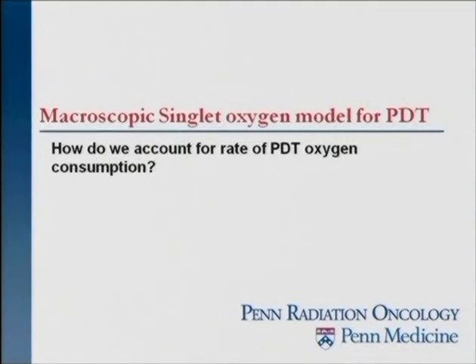So we talk about light, and we currently lack a good way of determining the sensitizer distribution. We can only know the sensitizer at a few different points on the surface. We want to use this method to determine the PDT dose.